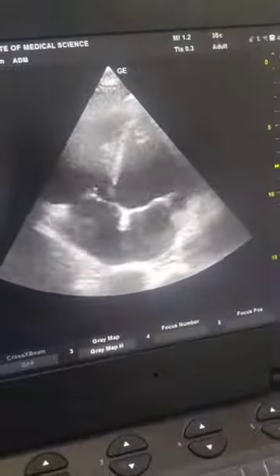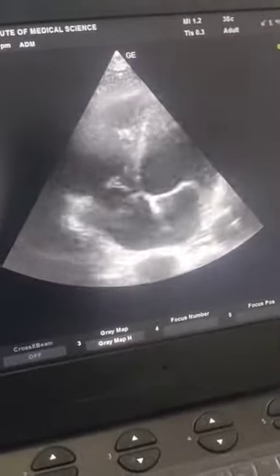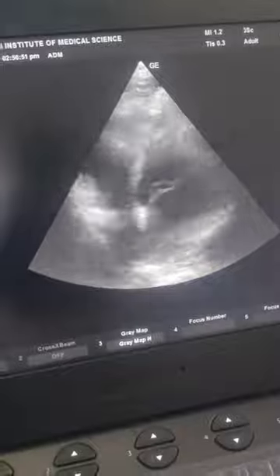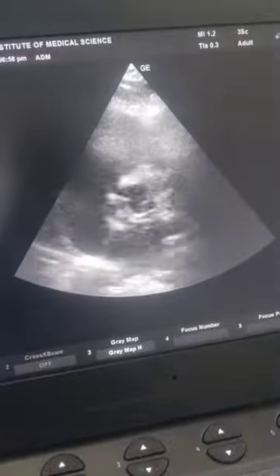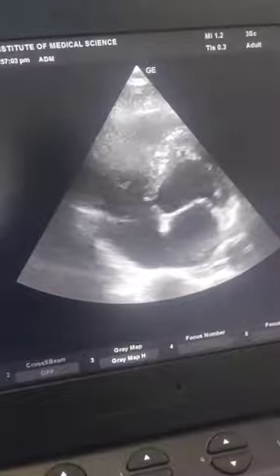The four chamber view is also giving us similar vibes. You can see the right ventricle here with the trabeculae, the moderator band, and the right atrium, left ventricle. Yeah, I think that's all more or less. That's the aorta, pulmonary artery, and that's it. Okay, let's close.